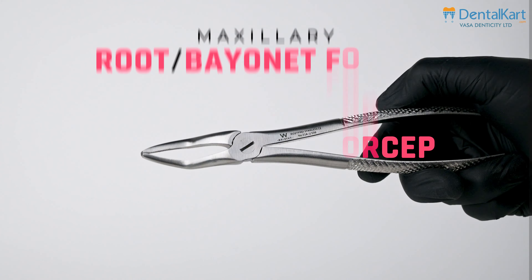Maxillary cowhorn forceps, named for their likeness to bovine horns, are crafted for extracting severely decayed maxillary molars. Their curved shape and pointed beaks provide excellent leverage and access to these teeth, ensuring swift and controlled extractions.